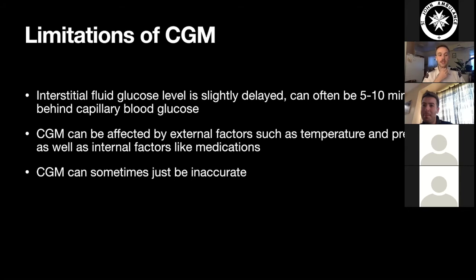So if you have a patient who really looks like that classic altered diabetic, they're pale, they're sweaty, they're loopy, they're not really making sense, and you're strongly suspecting a hypoglycemic event, and a family member pulls out the person's phone and says, no, look, their sugar's completely fine, it can't be that. That's where, especially if you're with St. John who carries a license to do that, or you're working in a work site with that, I would double check if your symptoms aren't making sense by doing a finger stick, because that is always going to be your gold standard accuracy there.